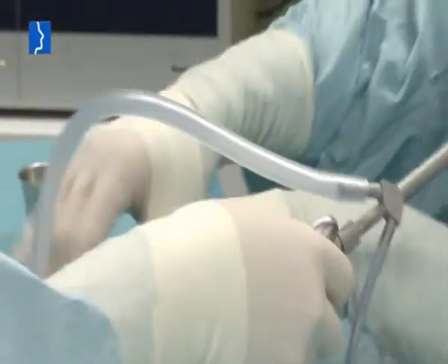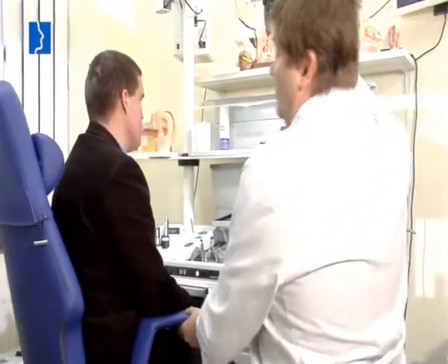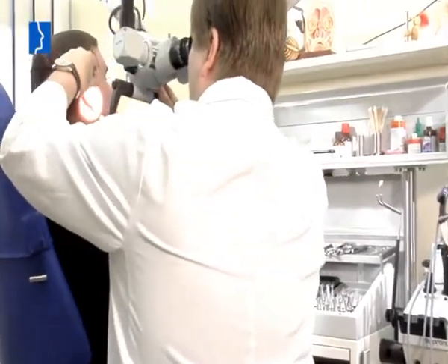Complications have not occurred in previously performed treatments. First studies have shown a clear improvement of the eustachian tube function, even after a year. The special new aspect of this method is that up to now, there has been no possibility of treating this functional disorder successfully, and for the first time, we're able to rectify this functional disorder by means of a balloon catheter, using an approach modeled from the dilation of coronary arteries.